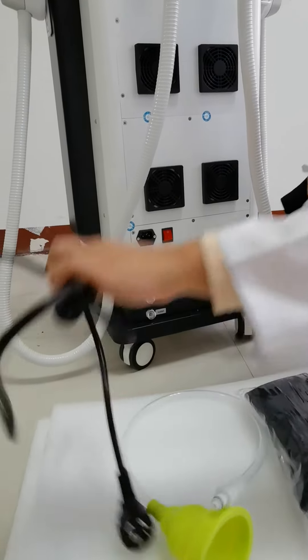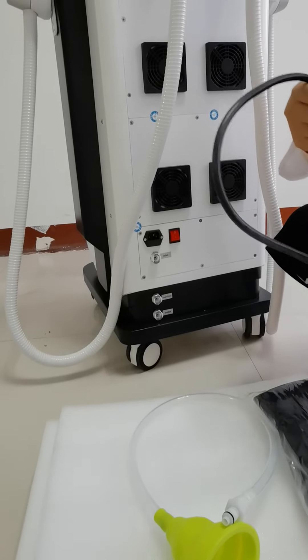Now let us connect the power and show you how to operate this machine.